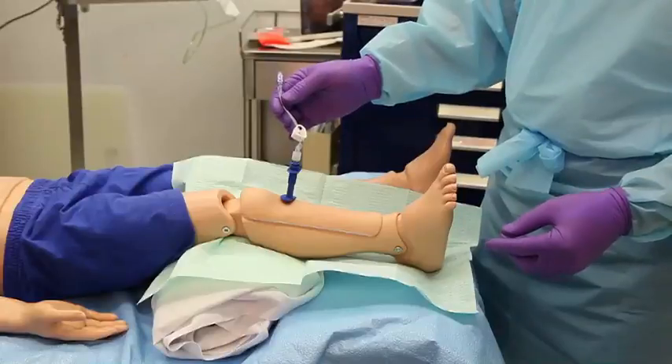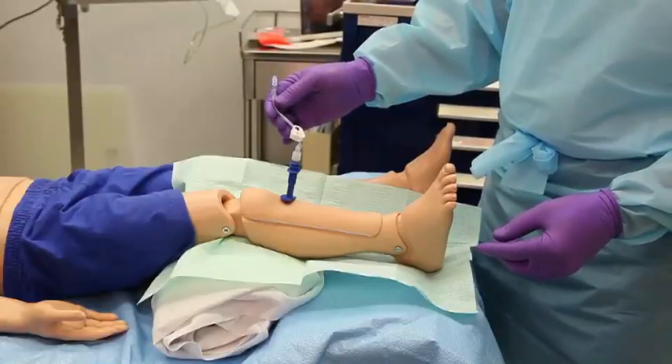Apply antibiotic ointment and sterile dressing, and secure the needle and tubing in place.